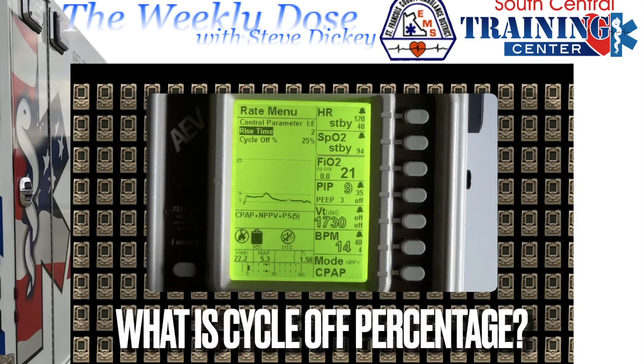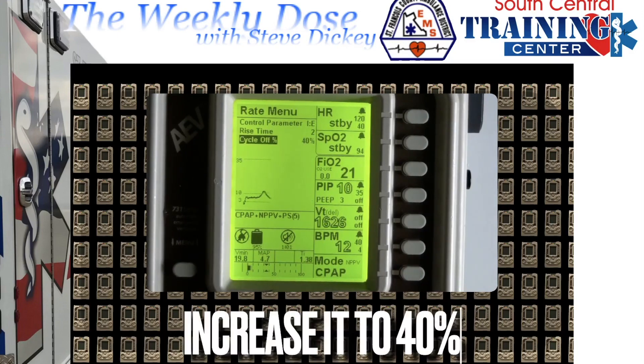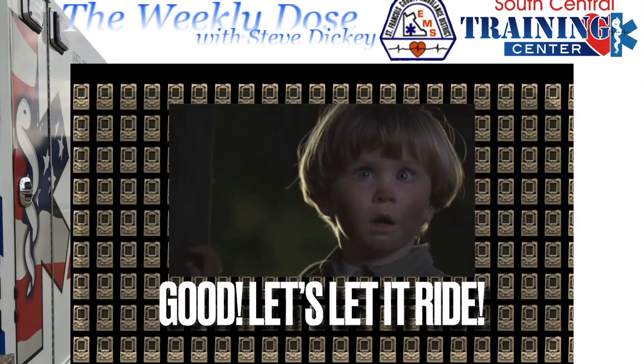Now adjust the cycle-off percentage. Cycle-off percentage is another part of the inspiratory phase that aids with allowing the breath to be assisted a little longer, or cuts it back sooner. Increasing the percentage allows more support of that inspiratory breath just a little longer. Not enough air — increase the percentage. You find the cycle-off percentage in the same place you find rise time. The default is 25%; in this situation, increase it to 40%. Better? Good — let's let it ride.